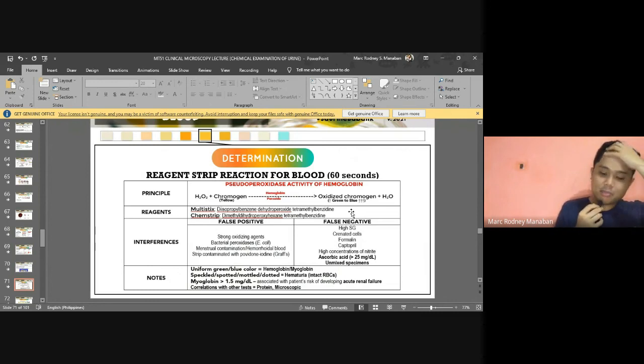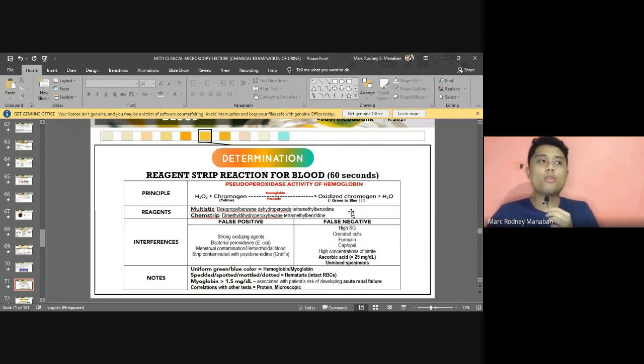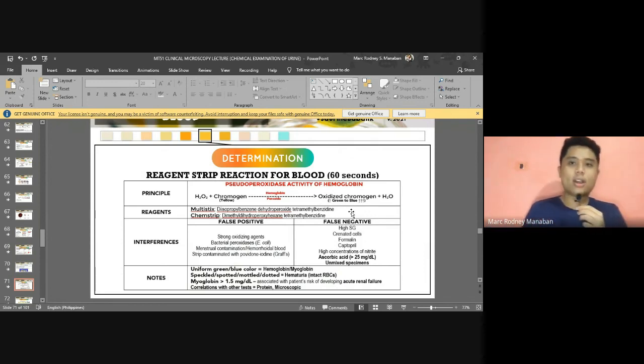Now, maybe you may be thinking, sir, so if ever gidugo ang patient, and then kailangan siya urinalysis, so dili siya pwedeng mo collect, no? Theoretically, yes, dapat dili yun. So pwede siya mo collect kung wala gyud siya gidugo karon or nag-period. Pero na ibang laboratories na mudawat lang, as long as inote siya sa specimen collection or sa result form na the specimen was collected during the period of the patient, or patient is undergoing menstrual cycle at the time of collection. Parang ganun. Basta inote lang siya.